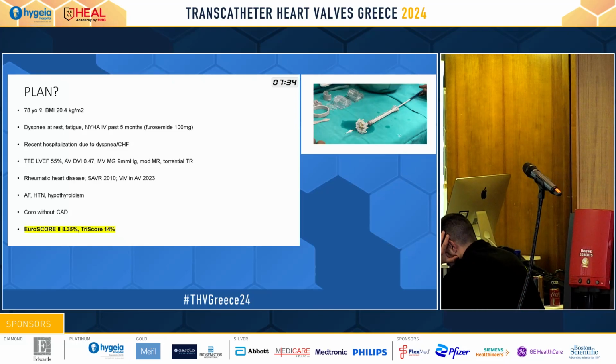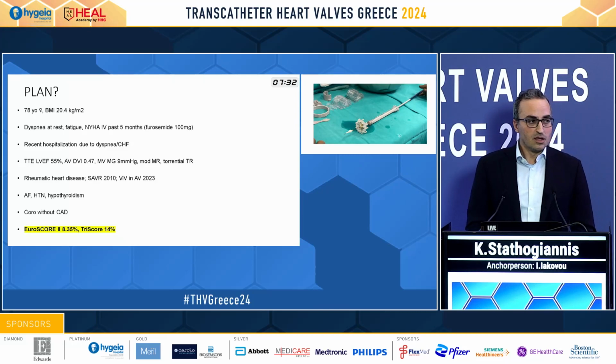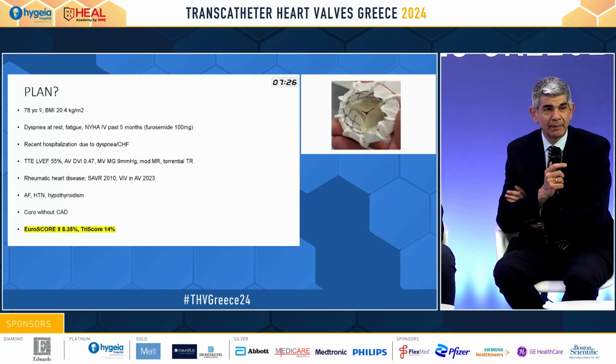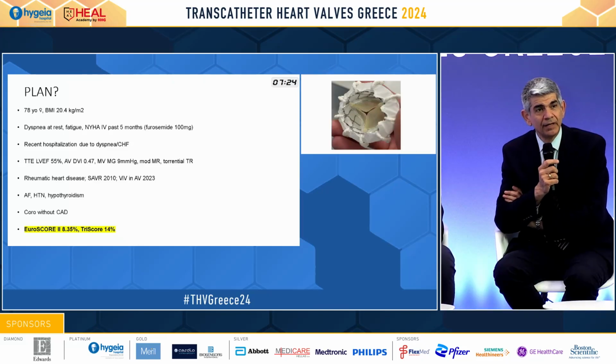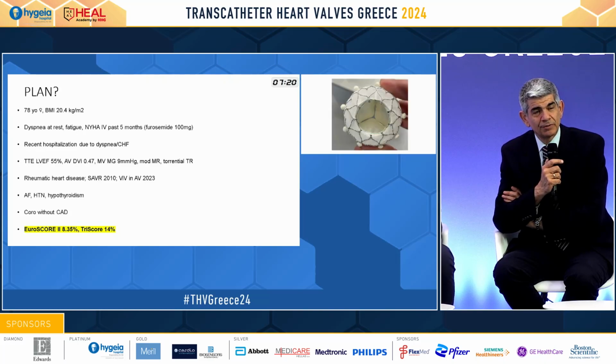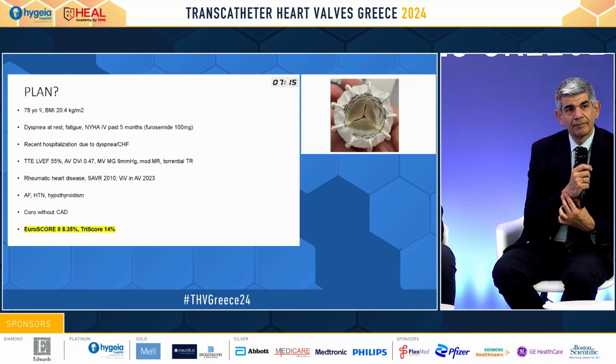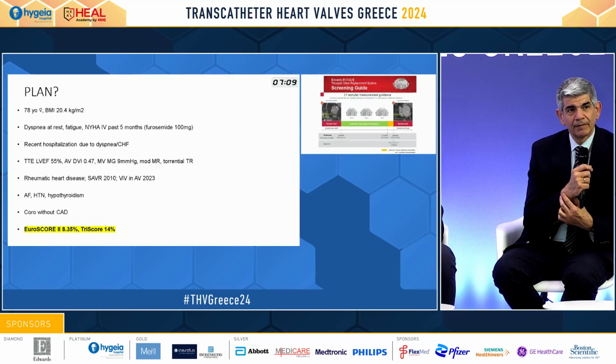Okay, so Michael, any comment on that? Would you be concerned about the pulmonary pressure of 55? She has good RV function based on TAPSE and RV S prime, but do you think that will cause any issues with the right ventricle? Well, your right ventricle has been slowly trained, so that's helpful, and certainly that wouldn't dissuade us from fixing her mitral valve. There's really no pulmonary pressure that's too high to fix mitral stenosis.